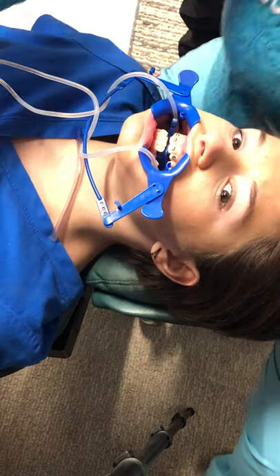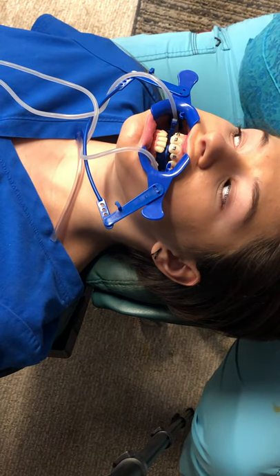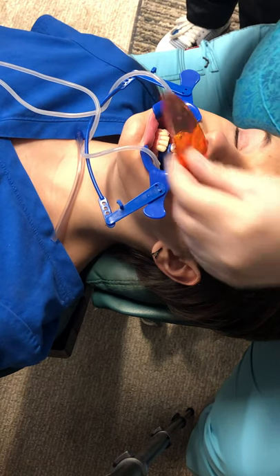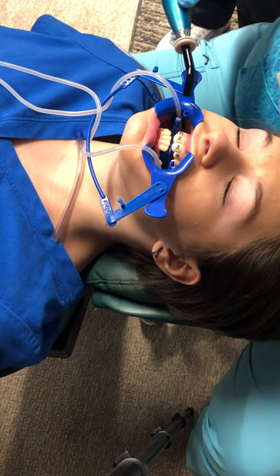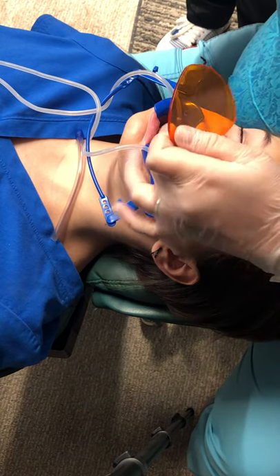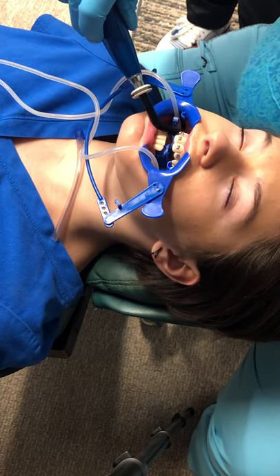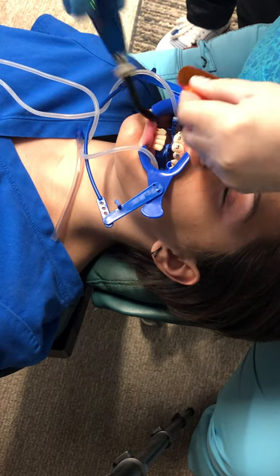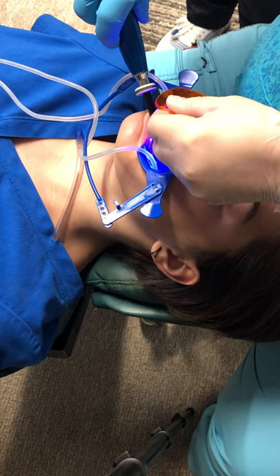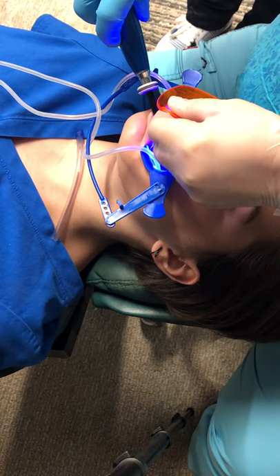If I touch that bracket it's going to move. So I'm going to put this on 20 seconds and put the amber shield here. But I can't put it on top of the bracket — light doesn't travel through metal. So I'm going to have the patient open a little bit and shine it right up the incisal edge to hit under the bracket. Depending on manufacturer, this is 20 seconds per tooth.